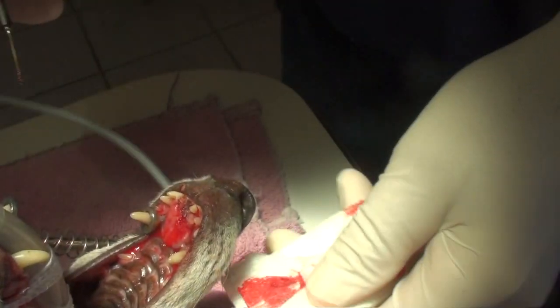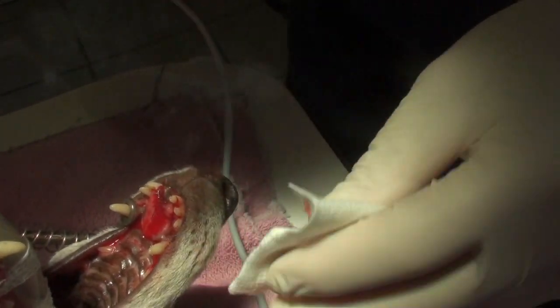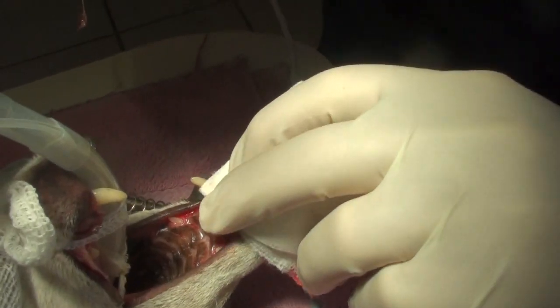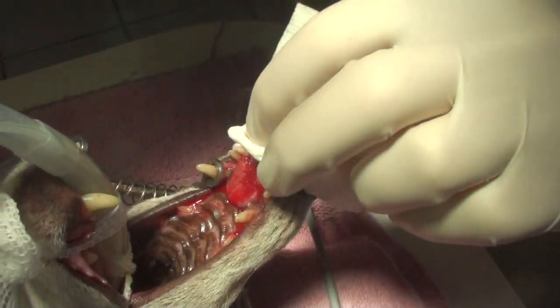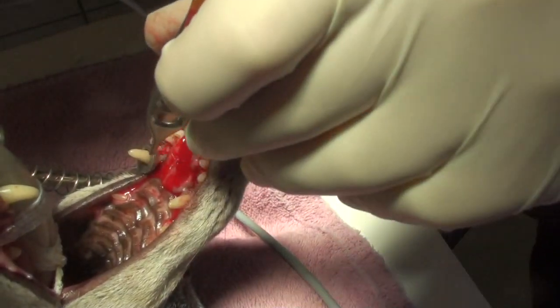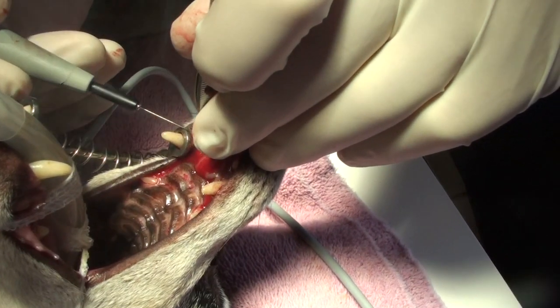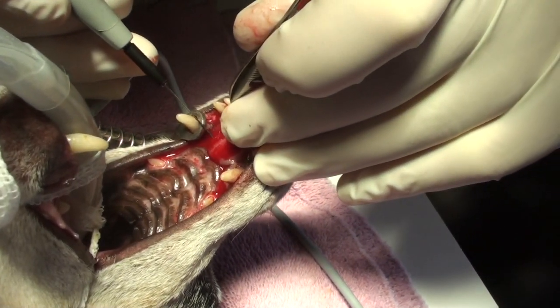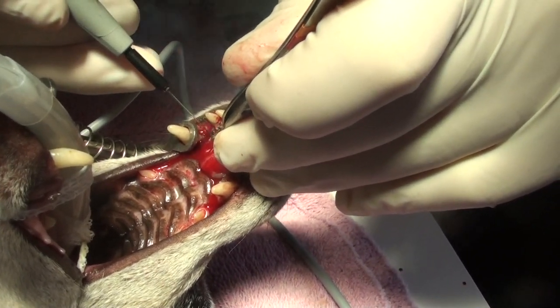Next, what I'm going to do is cauterize where it was bleeding from where the tooth was. I'm trying not to injure the teeth, but I have to get that tumor out. In order to get that tumor out, I have to burn the whole bed. So I cauterize it, and then use the cutting portion of the instrument to peel off the tumor from the roof of the mouth.